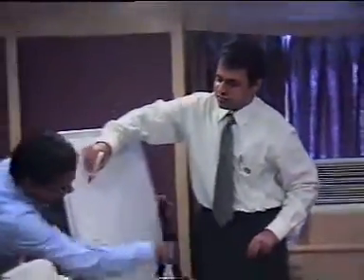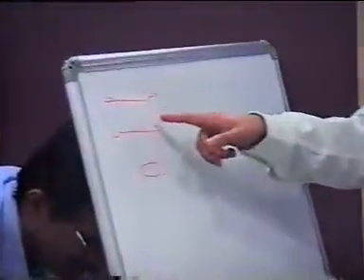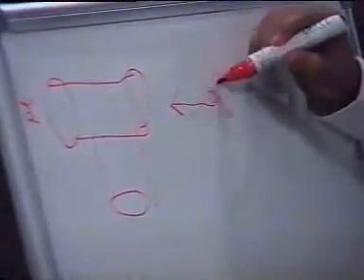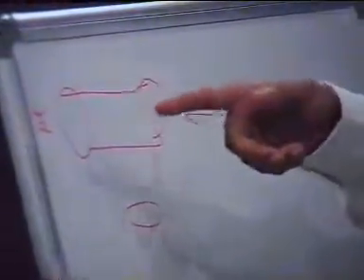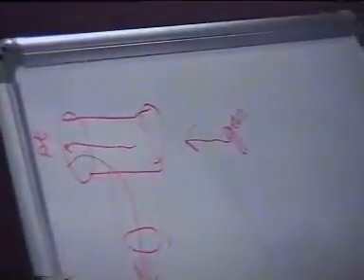Now what I want to tell you is, how does this ventilator begin? Since we are discussing the ventilator, it is based on the principle of Ayre's T-piece. All anesthetists use a lot of T-pieces. There are 3 limbs, actually 3 openings. You connect one to the patient end, and one to the gas source. The gas source is given here. During inspiration, the gas flow goes to the baby. During expiration, it goes out from here. This is when the baby is spontaneously breathing.